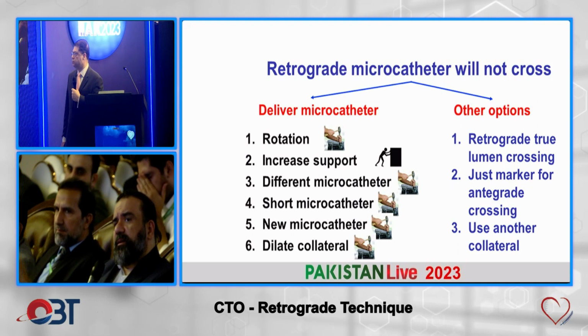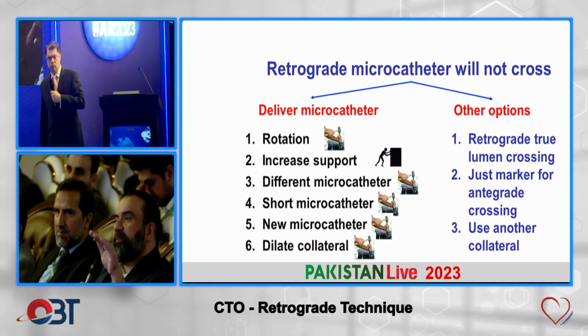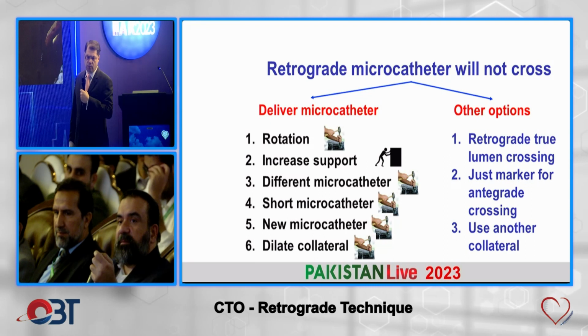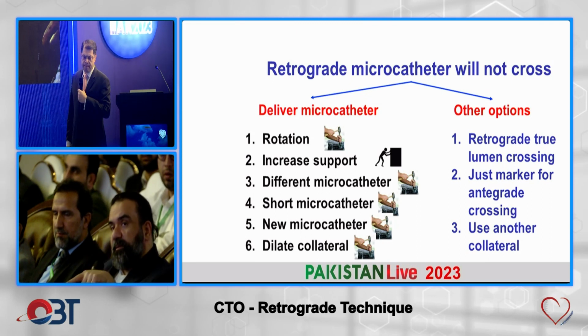What about the Turnpike Spiral or Turnpike Gold in crossing the septum? No, neither one. Turnpike Spiral is too bulky because we've got the extra nylon. I think it would traumatize the septal. The septal is relatively small. So you can use a Corsair, you can use a Turnpike, but not a Turnpike Spiral.